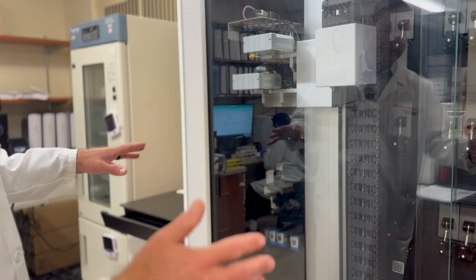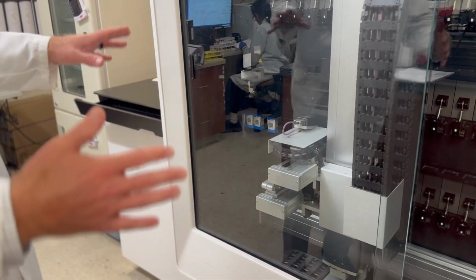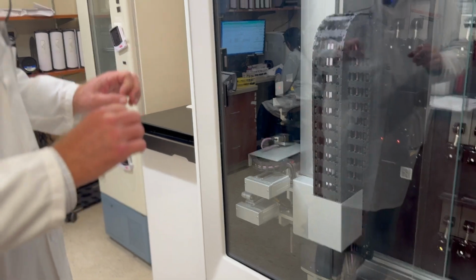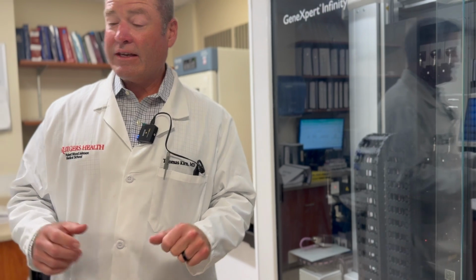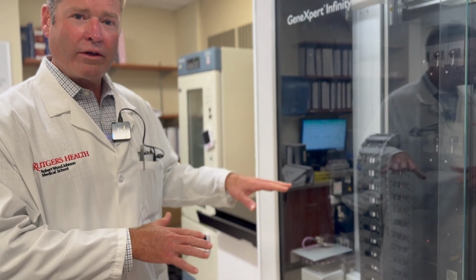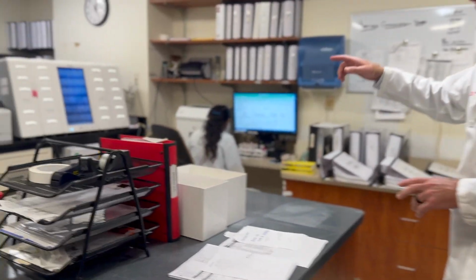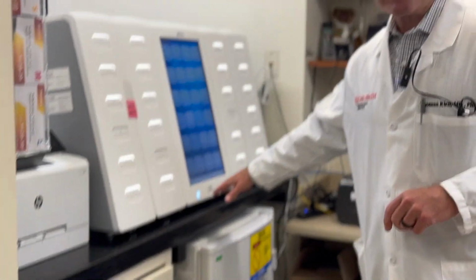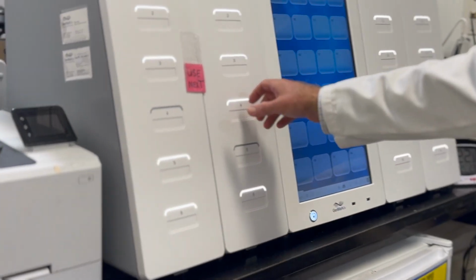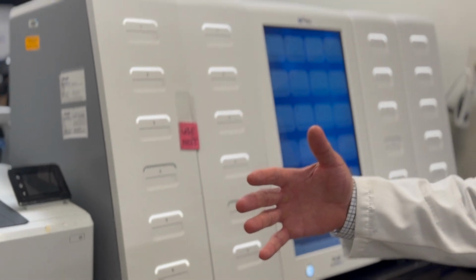So we can do many, many different tests at the same time, and the results come out generally in about an hour. So this is a rapid, on-demand system for doing molecular testing for infectious diseases. And in addition to that, we're really looking for 1 or 2 or 3 different bacteria or viruses. We also have methods to detect many, many different organisms at the same time, and an example of that is over here. So this is called the GenMark DX instrument, and this instrument uses a cartridge-based system. It's kind of similar to what we saw with the GeneXpert, but in this case, it's massively multiplexed.